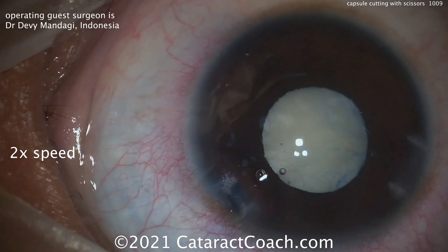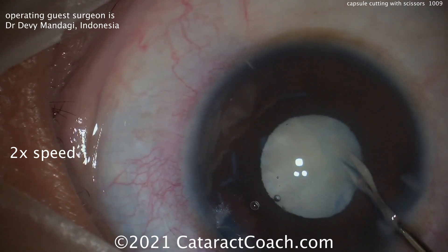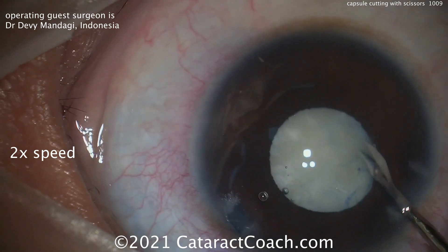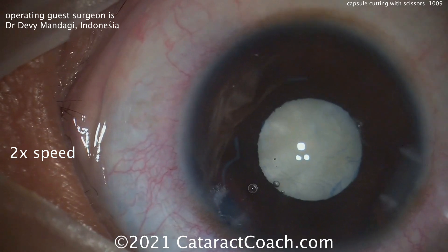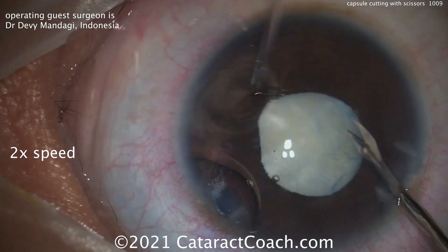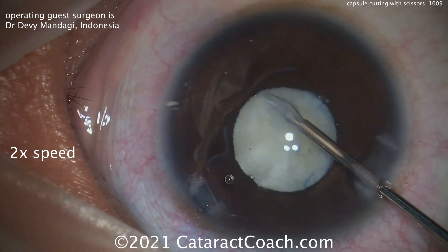So instead, micro scissors are being placed here via these incisions to cut an opening in the anterior lens capsule. Now a cut opening is not going to be as strong as a torn capsulorhexis — the advantage of the torn capsulorhexis is its strength. But in this case, you don't have a choice. There's not going to be a way for you to tear a rhexis, as you can see. He's forced to use the micro scissors in order to make a capsular opening here.